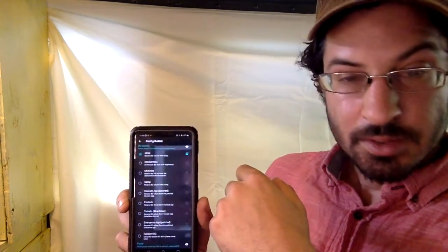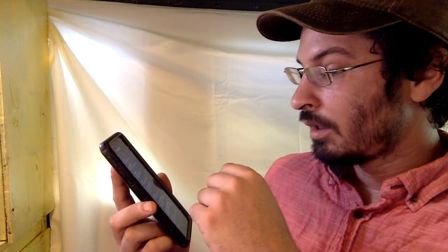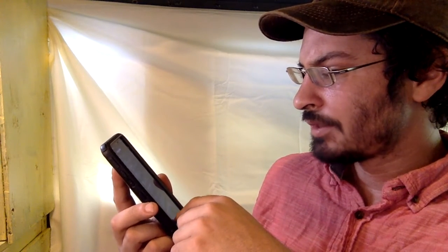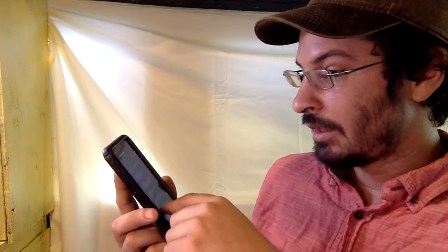Blood glucose source, I'm using xDrip. Glimp is an option. Tomato is an option. Eversense is an option. Dexcom, obviously, the patched Dexcom app is an option. Nightscout is an option. You can get your data online.